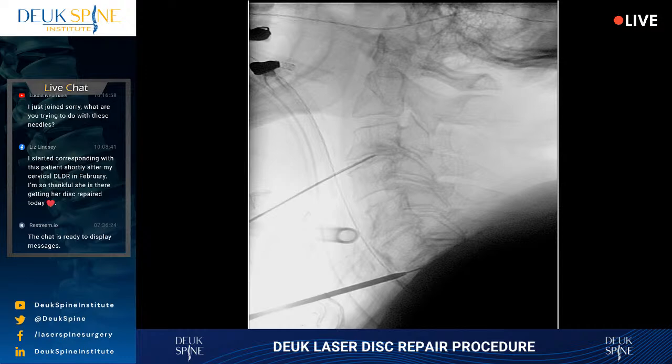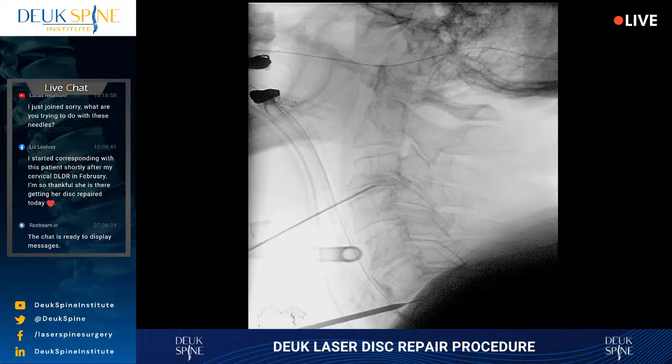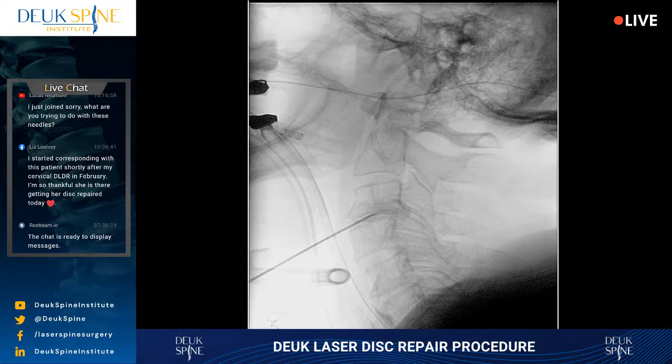Let's try to get our picture. So I'm taking time right now, stopping the surgery and waiting for my technician to line up the fluoro better. You see those 2 dots in the back of C6? Let's try to line those up. Those are kind of the pedicles. If we can get them a little bit better lined up, that's definitely an improvement, but I think we could do a slight bit better. Because I have to use the X-ray picture to navigate to where I want to go, I think that's worse, if you ask me. Whatever we did, we made it worse.